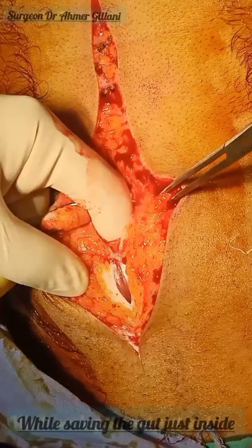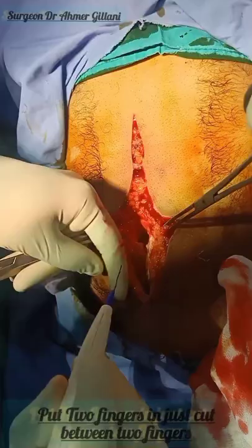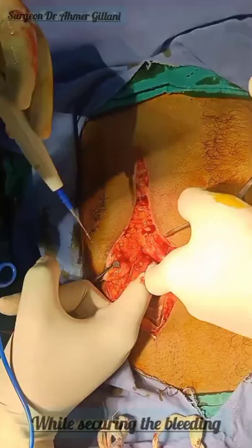We are cutting the other layers using the cautery. Remember: above the umbilicus, both the anterior rectus sheath and posterior rectus sheath are present. Below the umbilicus, only the anterior rectus sheath is there — the posterior rectus sheath is absent, it is deficient. Now we are proceeding in the upward direction for our incision for better exposure and better manipulation.